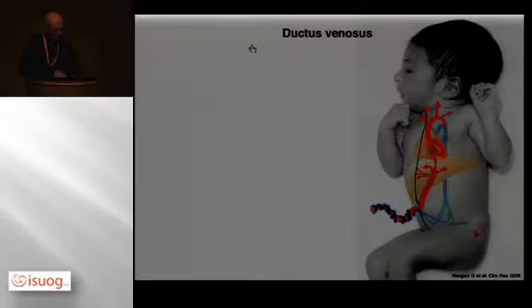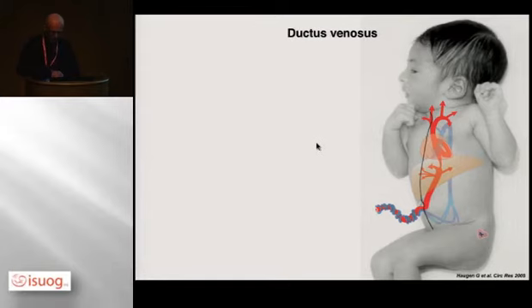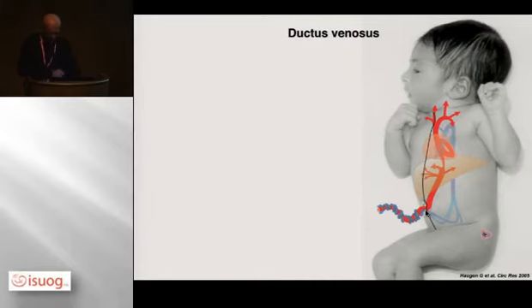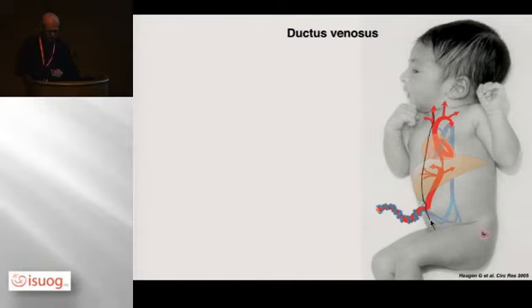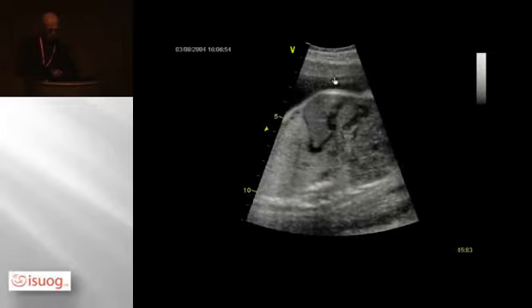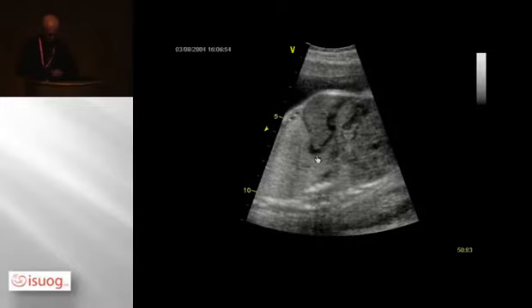You can also do the insonation in a sagittal plane, which means along the abdomen. And if you can insonate from the front, then you have no ribs and no spine, and then you preferably insonate from below here to get the angle as good as possible. That's what you have here. This umbilical vein, the ductus venosus comes here, and you see that the insonation now will still be at some angle of the ductus venosus, but now you can control it. So if you move this further down, you can get an insonation in this direction, which would be perfect.